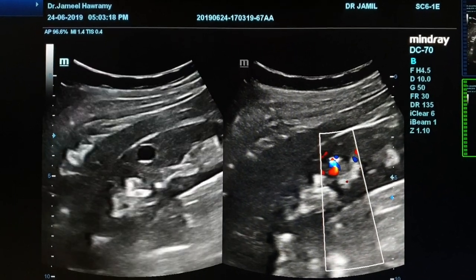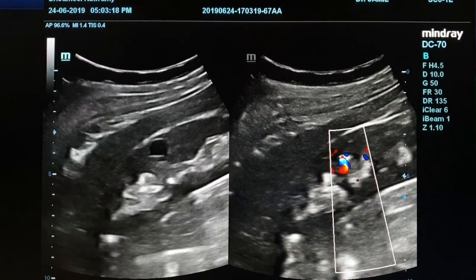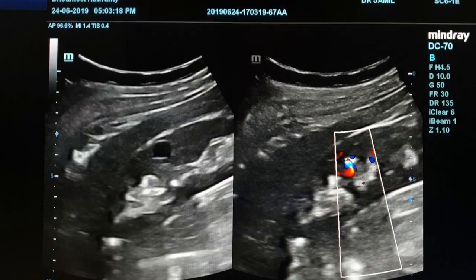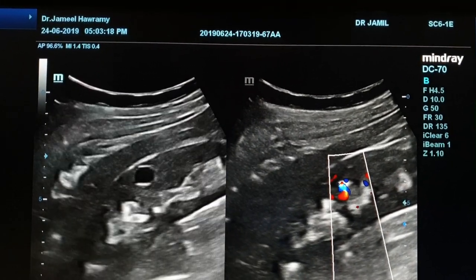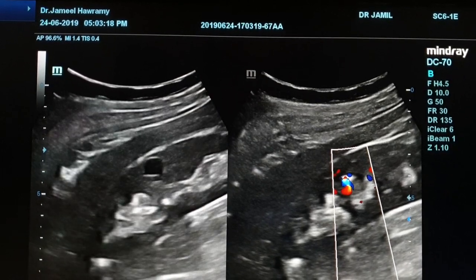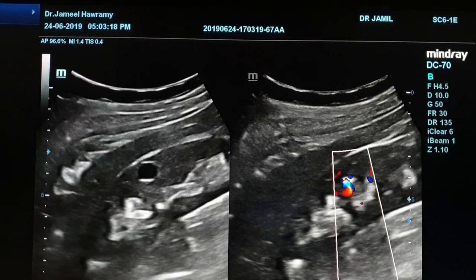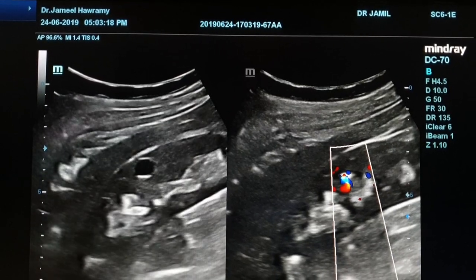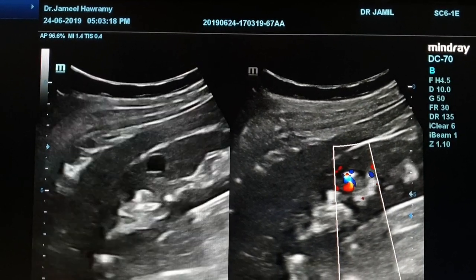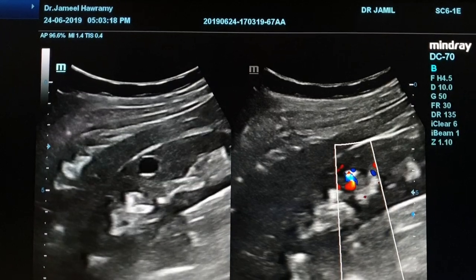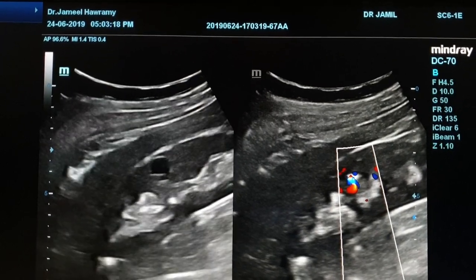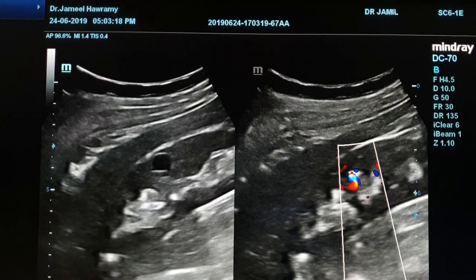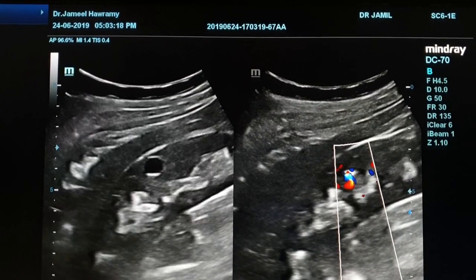On renal ultrasound, in the midpole, we see a cystic area with echogenic content. On color Doppler, the echogenic focus is showing a twinkle artifact. The echogenic content is seen in the dependent portion — this is called milk of calcium. It is sometimes misinterpreted as a renal stone, which is not the case; it is milk of calcium.